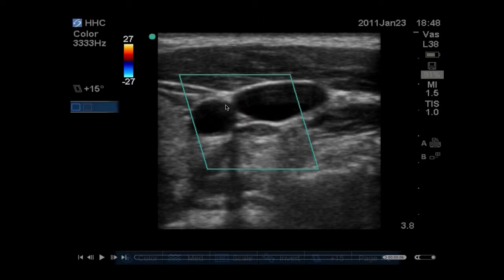And some people think, hey, well, if I'm using Doppler, the artery should show up red, and this one, because it's a vein, should show up blue. And really, that's not the case. It's not smart enough to do that. It basically is just giving you a color variance depending on the ability of the probe to detect where the flow is coming from and going. So, in fact, color differentiation is not that helpful, and I would discourage you from using Doppler until you get a little more skilled.